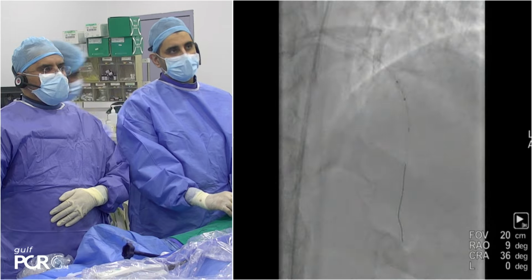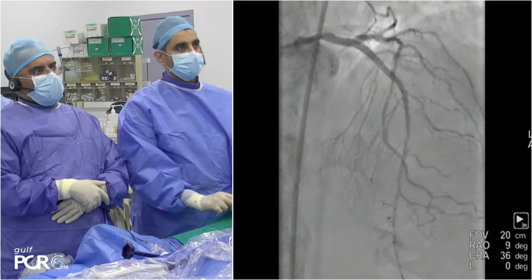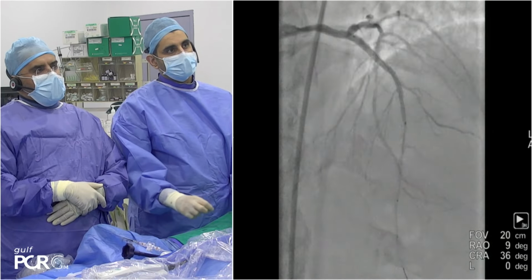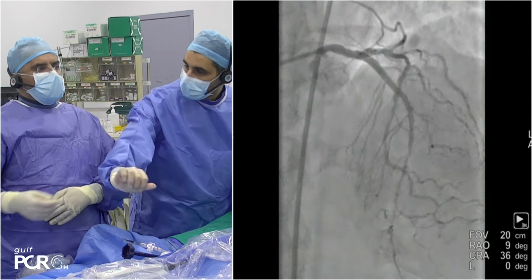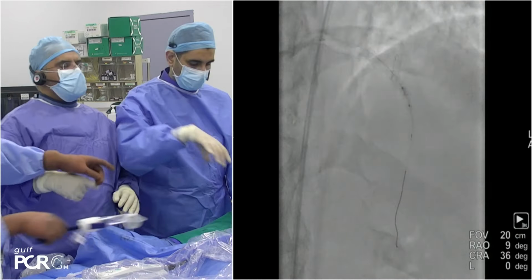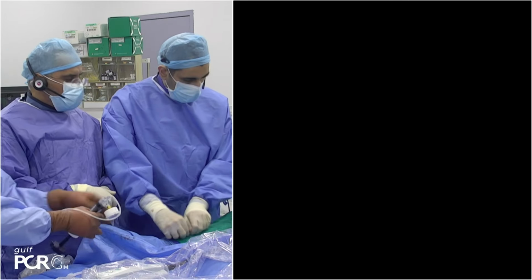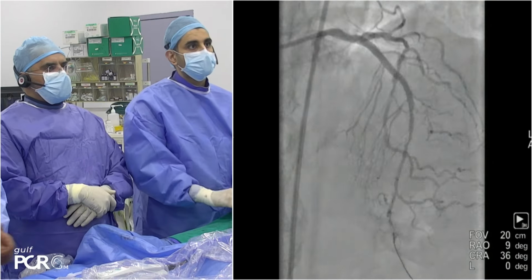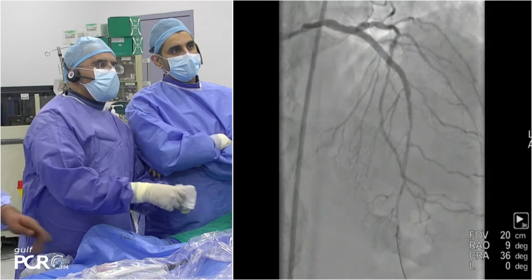Okay, fine. This is the one before post-dilatation. Quite diseased, even if you look at this one angiographically. Even angiographically, you couldn't convince people who don't do OCT, because they will tell you angiographically they would not have been happy. Because it is quite hazy in the outflow.